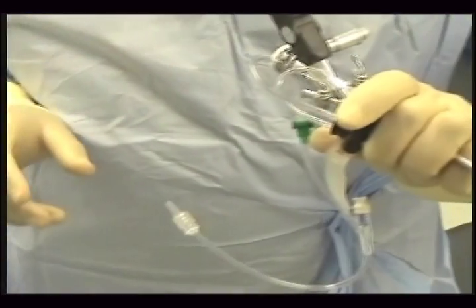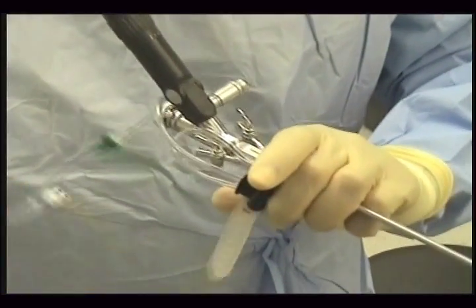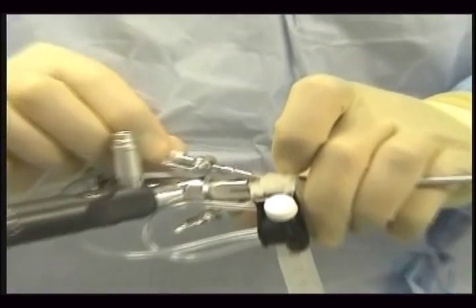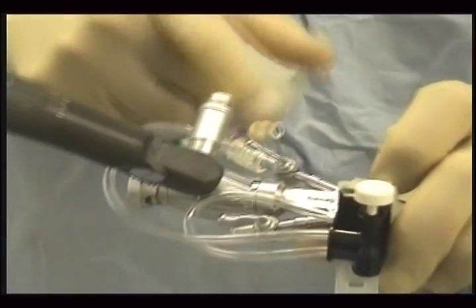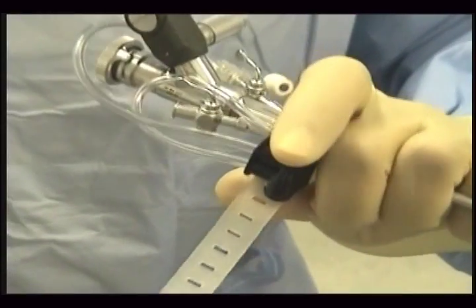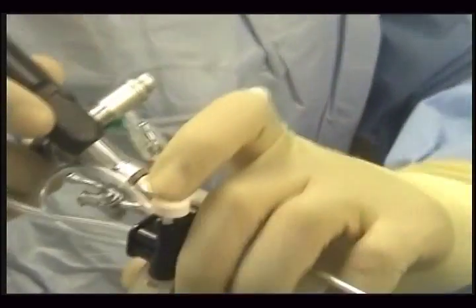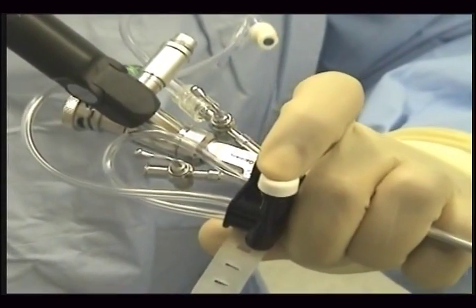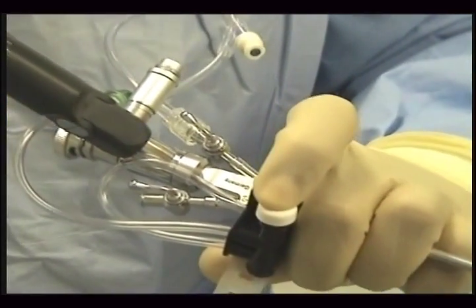If you want to hold the scope like this, the outlet tubing will go into the irrigation port here. And the valve will stay here. You can operate the valve with your thumb and your finger. Your right hand is completely free for instrumentation.